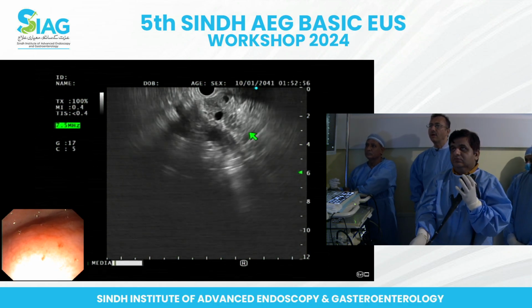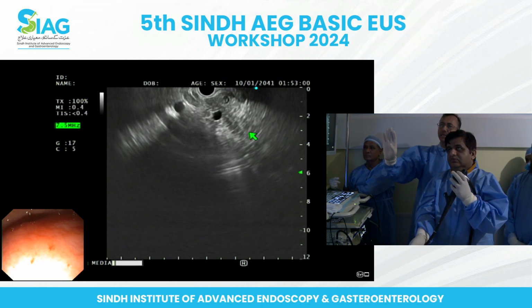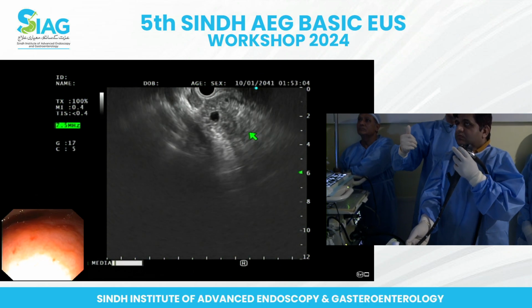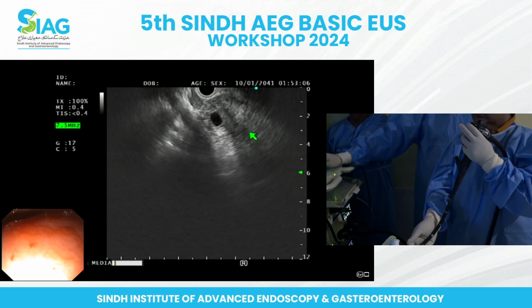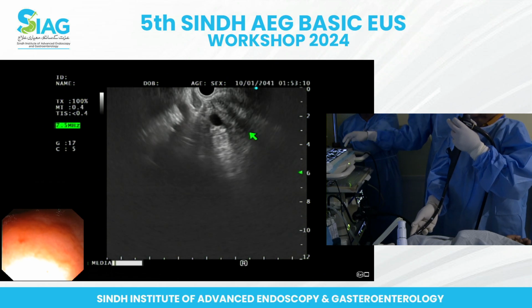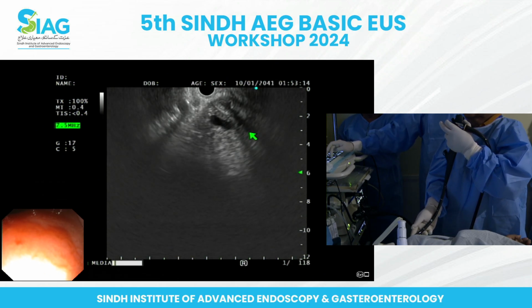Follow to the right. Forget about the portal vein now. You are concentrating on the pancreatic duct now. So follow the pancreatic duct to the right and to the left. Right? One thing is sure, that we are looking at the duct, and we can measure this as well.